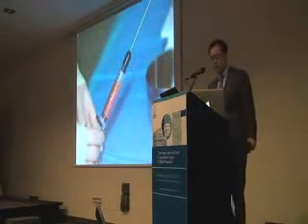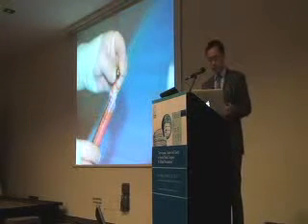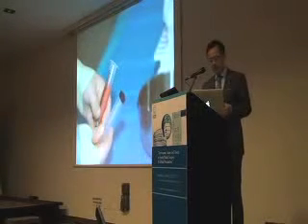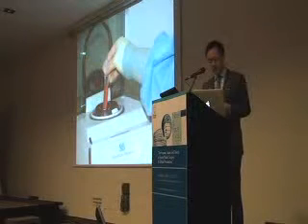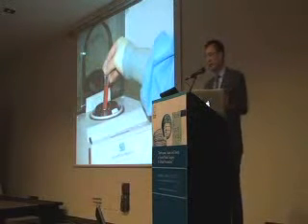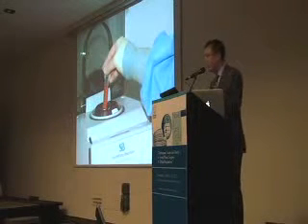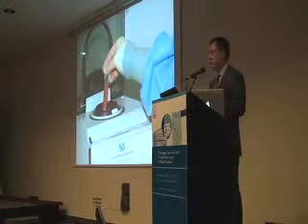This is just showing you, after I've harvested the fat with a few cc's of negative pressure, I put a cap on one end, and then I pull off the back end of this, and then I cap it. Then, sterilely, I place it into the centrifuge. You don't need to. That's the other thing that's so important: people usually come up to me after this talk and ask, how long did you do it? There's this rain dance voodoo with processing fat. I've worked with surgeons that have done it with washing. They've shown me beautiful long-term results.